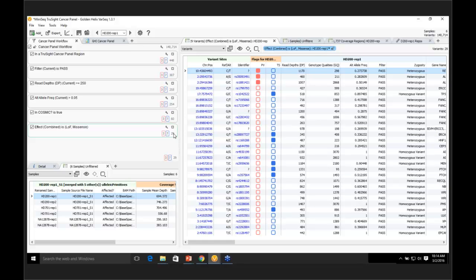Now at this point, we want to determine which variants we're going to say are primary findings and which variants we want to say are secondary findings for the purposes of including the variants in a report. In this case, we have selected 3 variants, highlighted here in red, as primary findings. And I'll spend a little bit of time going over the reason for selecting these specific variants.